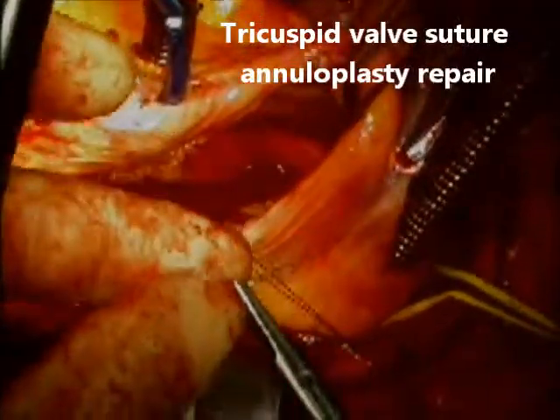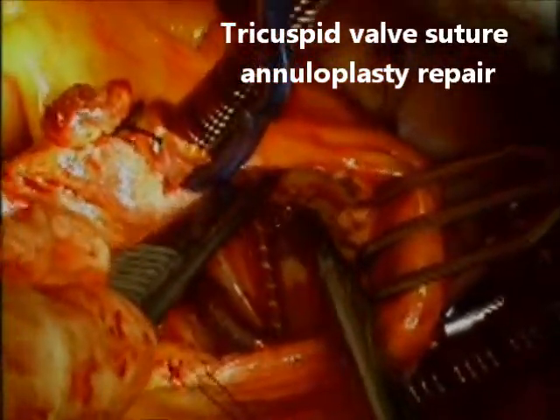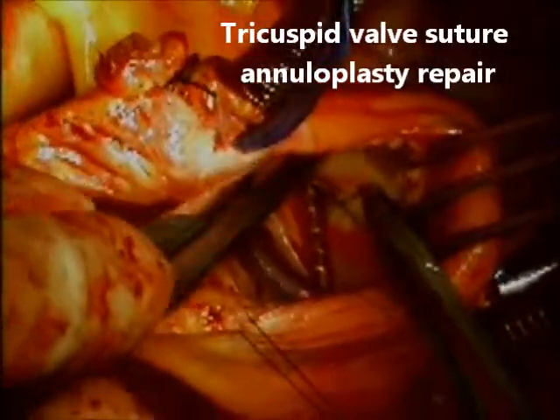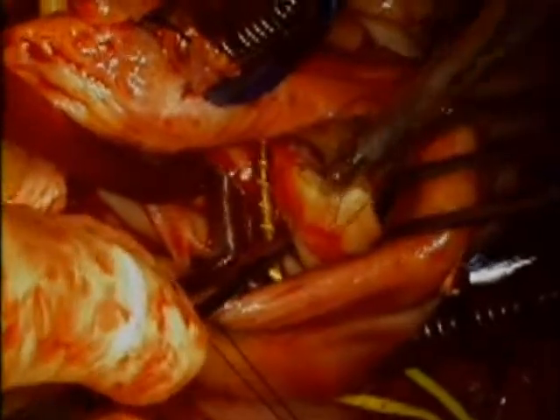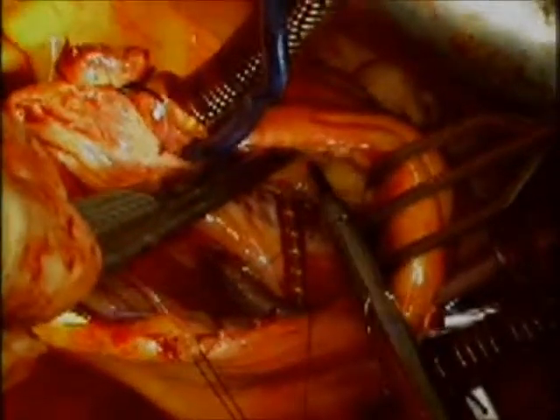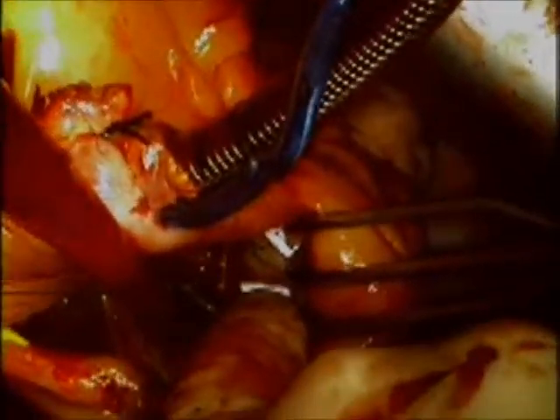Traction stitches are placed to open the right atrium, and now you see me perform a suture annuloplasty repair. I use a Kay technique — most of the time a pledgeted stitch in 2-0 prolene which pinches off the commissure between the anterior and posterior leaflet. Most of the time one single pledgeted stitch, if adequately placed, is enough to give a very good repair. I have done over 300 repairs this way and my follow-up studies show excellent results in terms of permanent repair and competence of the tricuspid valve.